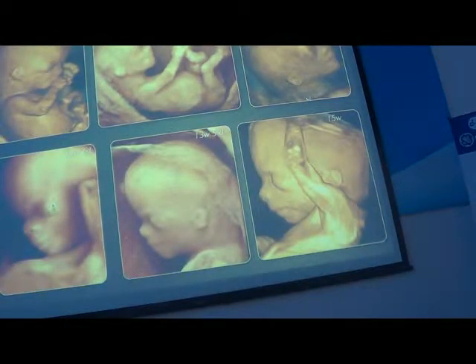And exophthalmia is normal in the first trimester of the pregnancy and also in the first part of the second trimester. You can see the eyes are slightly bulging.